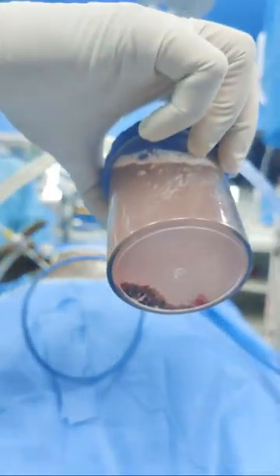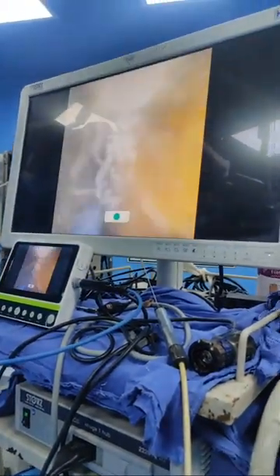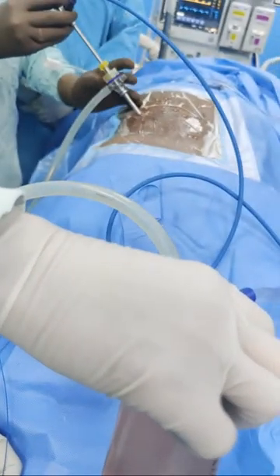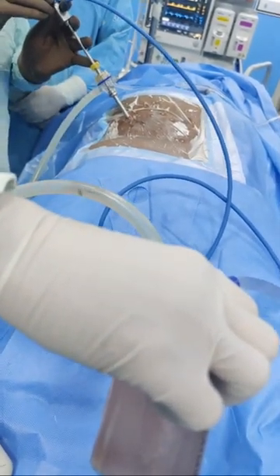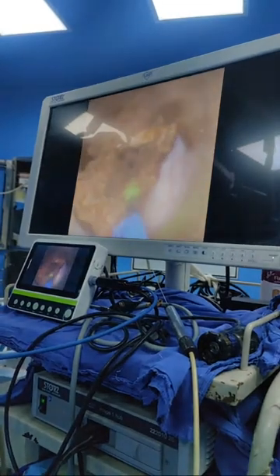Without the use of a forceps. And the stone is coming. See how the stone comes. The stone immediately waits for the sheath to come in. Beautiful demonstration by sir.